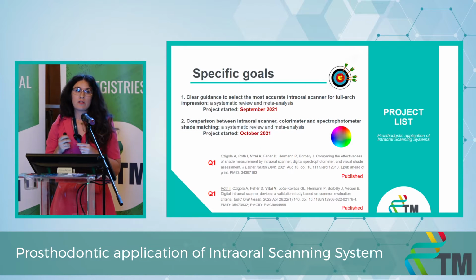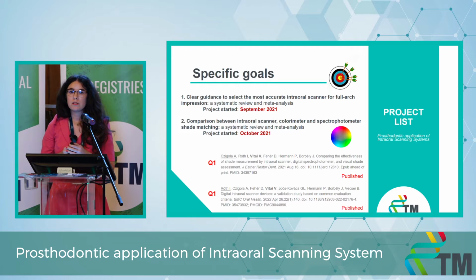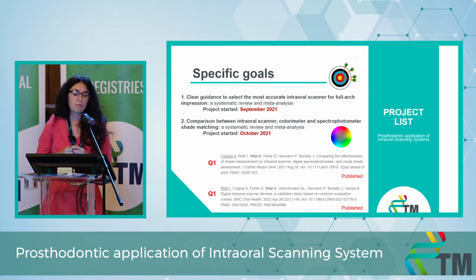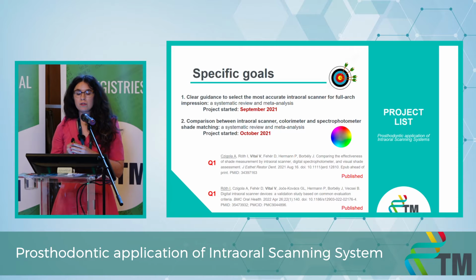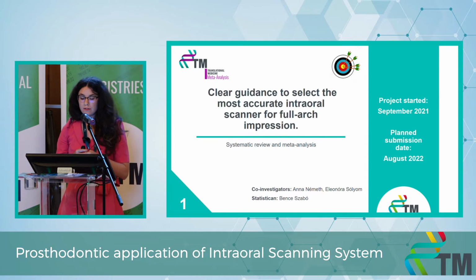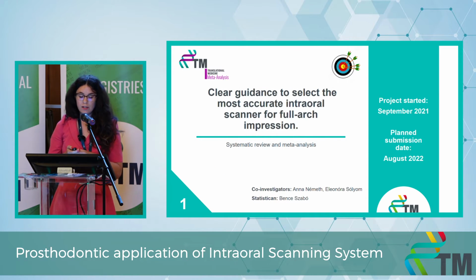Intraoral scanners are not just impression machines, but they also have some special features to help our dental practice. Therefore, my first meta-analysis is connected to the accuracy part of intraoral scanners, and the second one is connected to the tooth shade determination part of them. So, the first topic is the clear guidance to select the most accurate intraoral scanner for full arch impressions.